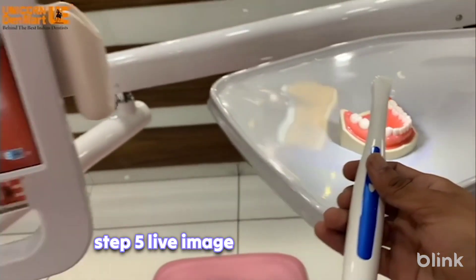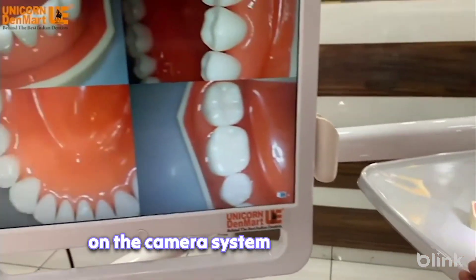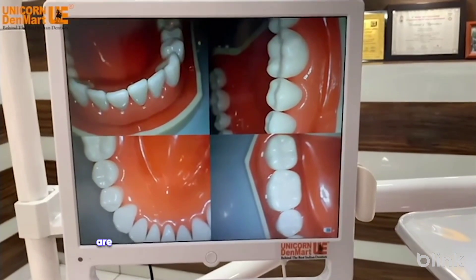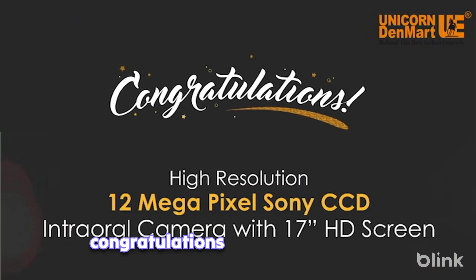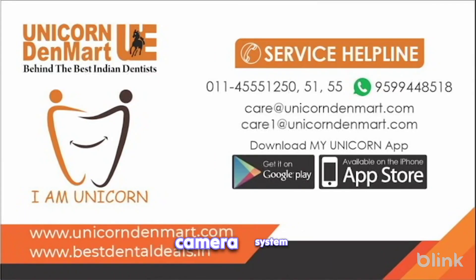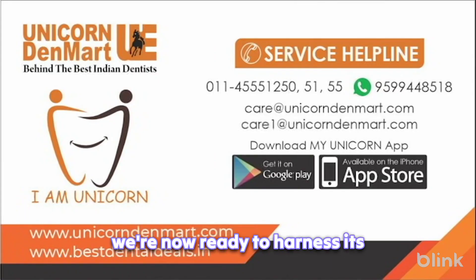Step 5: Live image display. Power on the camera system to experience real-time magic as captured images are seamlessly displayed on the LCD screen. Congratulations! With the successful installation of your intraoral camera system, you're now ready to harness its benefits.